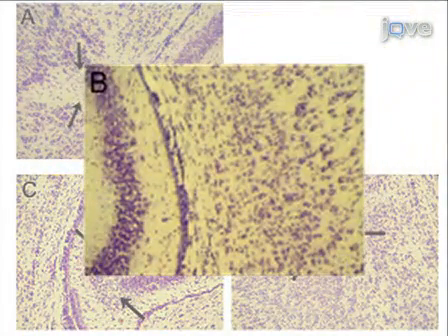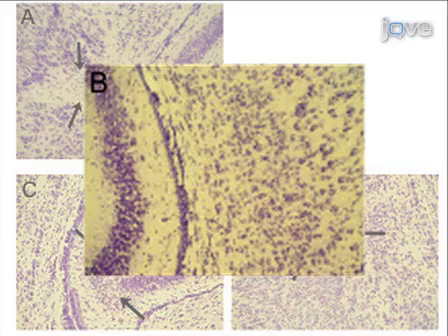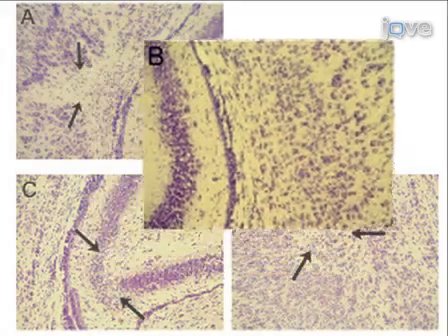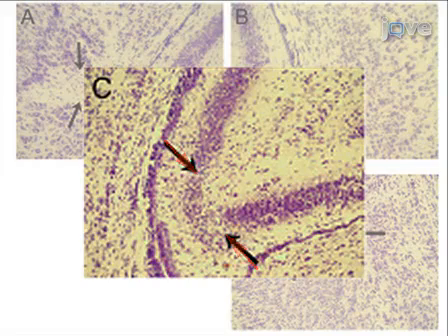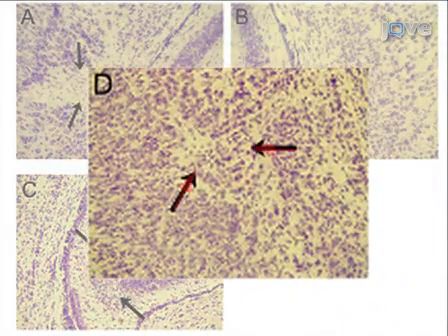In the contralateral central white matter, the oligodendroglial nuclei are arranged in fascicular-like bundles. This architecture is completely disrupted by the focal necrosis on the ipsilateral side. In brains with ipsilateral cerebral white matter injury, ipsilateral necrosis in the hippocampus and focal microinfarcts in the thalamus are also observed.